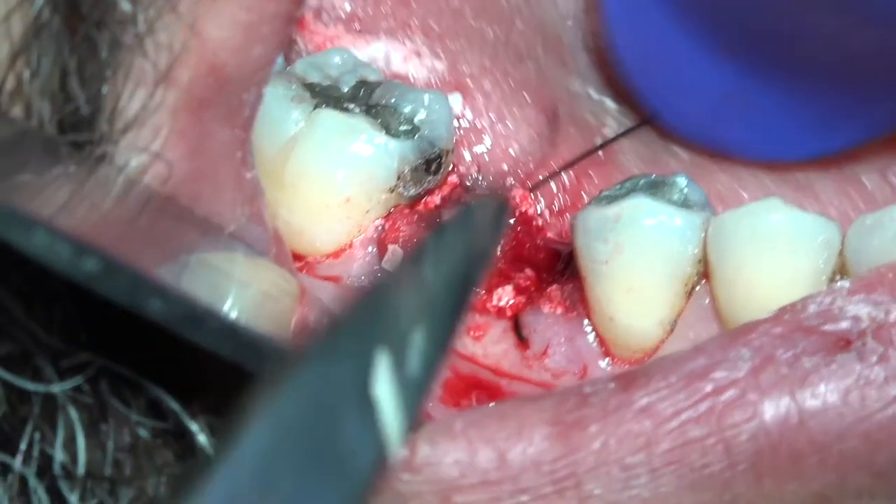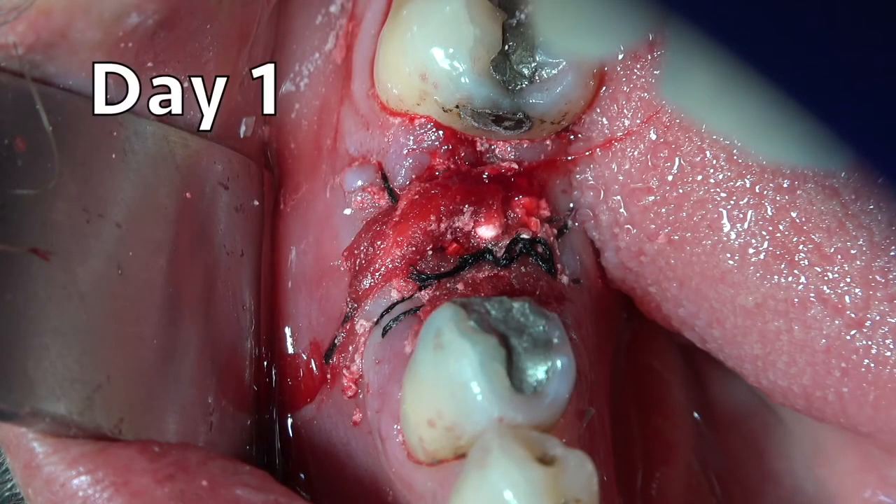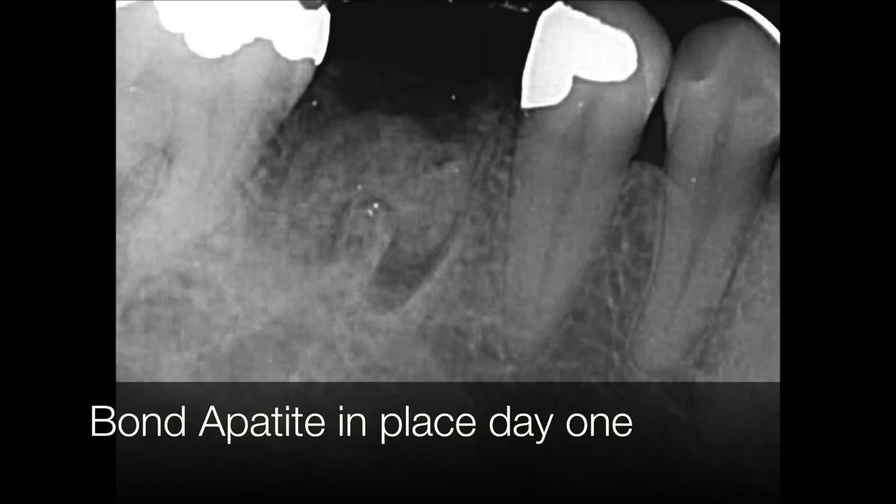As you can see, there is no need for any adaptation — you just place it above. That's how it looks on day 1 immediately after surgery. There is no fear because soft tissue knows how to migrate rapidly and safely above the graft due to the nature of the cement.